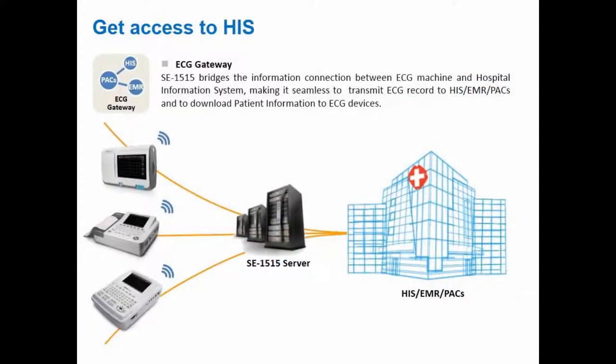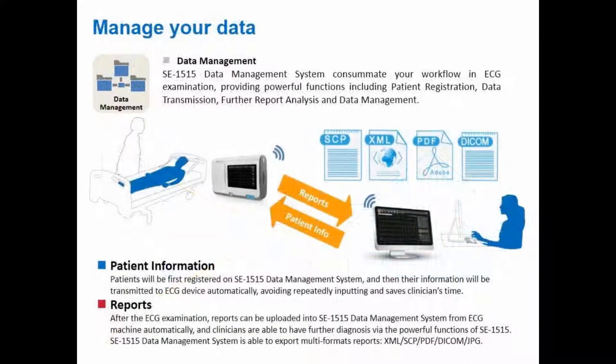As a network gateway, SE 1515 bridges a solid bidirectional communication between your EDAN ECG machines and information system, making it easy to transmit the ECG record to the EMR, PACS, and to download patient information to ECG devices.